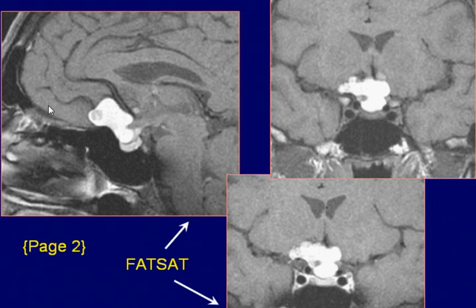Sagittal post-GAD fat saturation T1-weighted image demonstrates the lesion as a hyperintensity area in the supra-sellar region with a slightly lobulated outline.